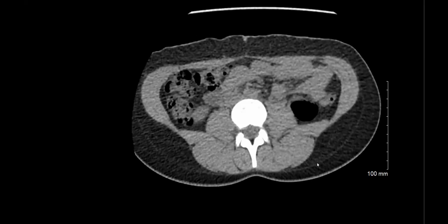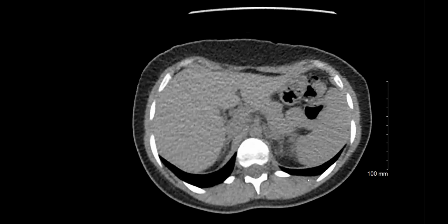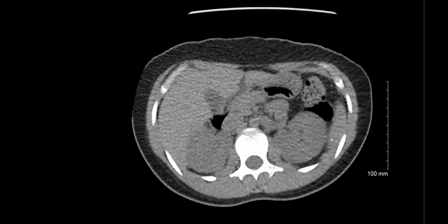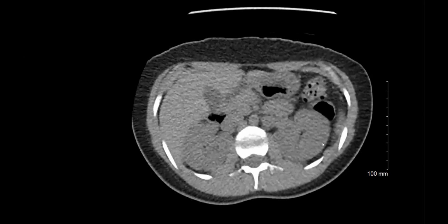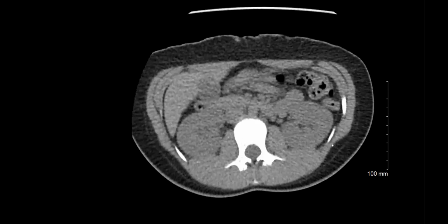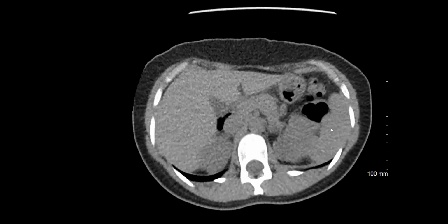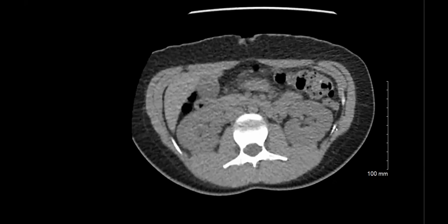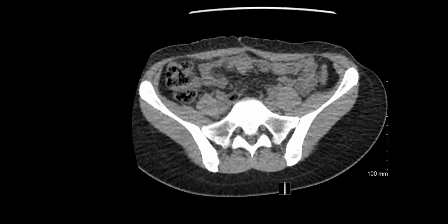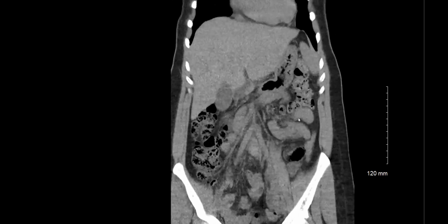The only complaint she came in with was recurrent UTIs. And apparently she was investigated as a child, but then due to some economic and financial issues, it went unnoticed. And they moved countries, and now she presented to a urologist here. So I'm just quickly going to scroll through a non-contrast CT that she had on our PACS system from 2015.